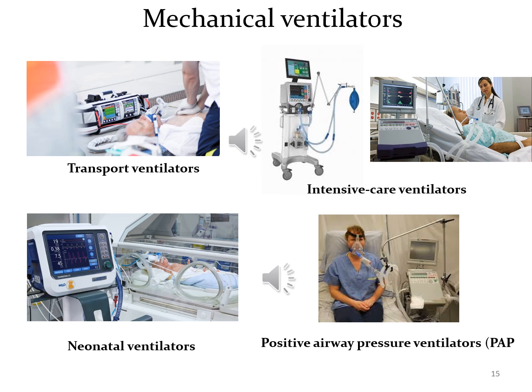This style of ventilator often provides greater control of a wide variety of ventilation parameters. Many ICU ventilators also incorporate graphics to provide visual feedback of each breath.